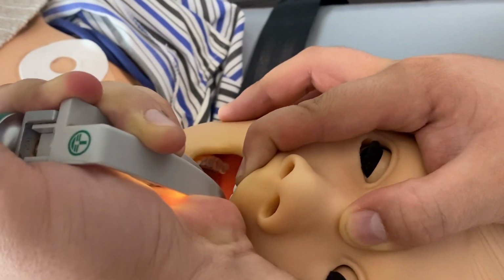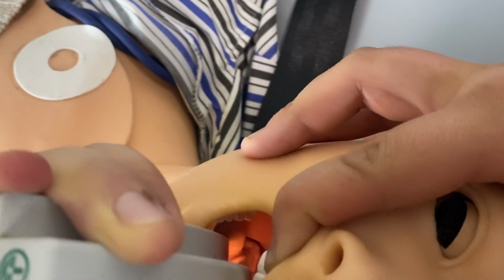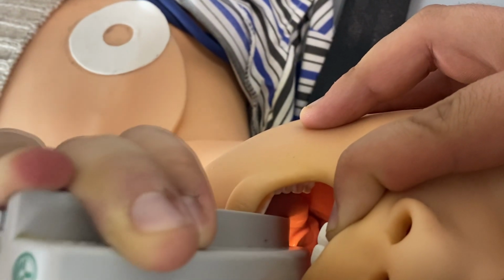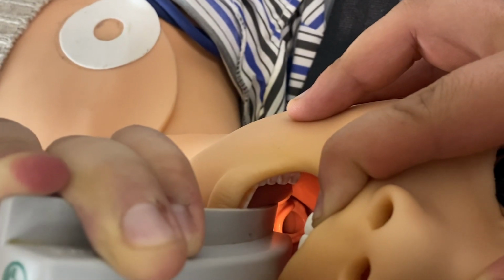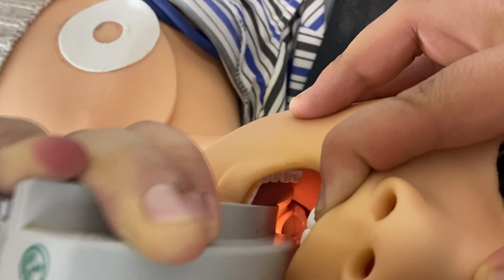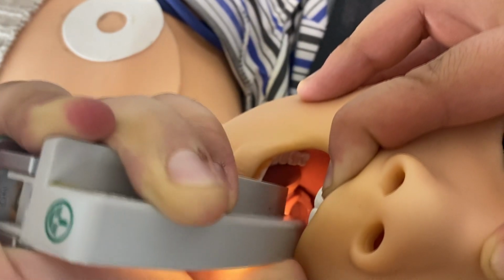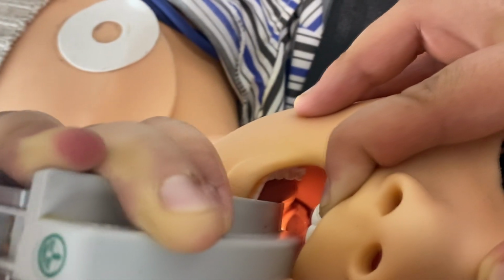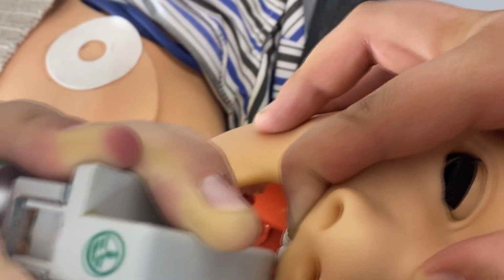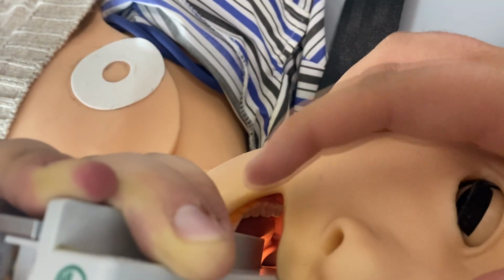freely. And here on the mannequin you will see that there is a really large hole inside. So you see that I am in the vallecula, which is the space between the tongue and the epiglottis. Then you see the half moon shaped epiglottis, which is hanging freely, and under it there is a big hole, and right now you cannot see that actually, but it does have something resembling the vocal cords.